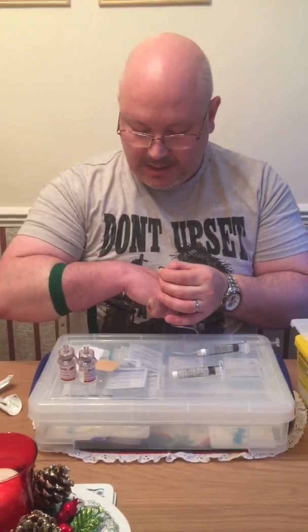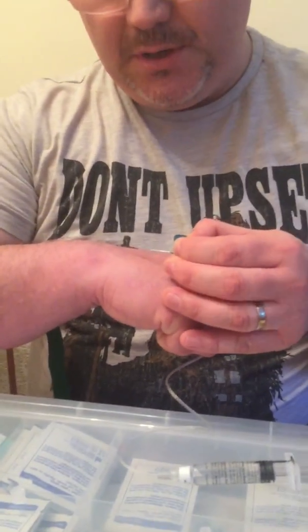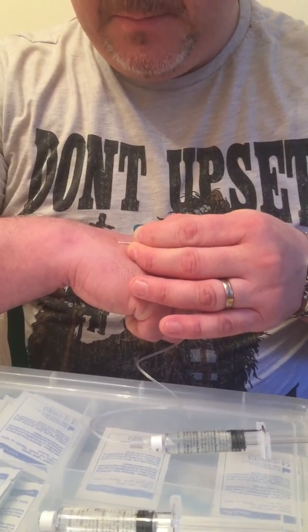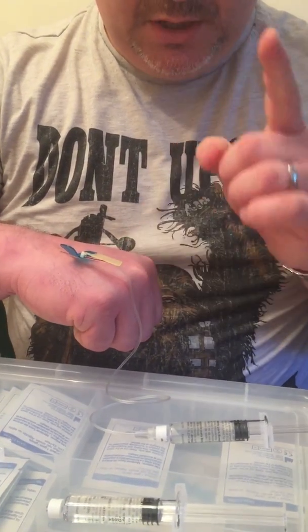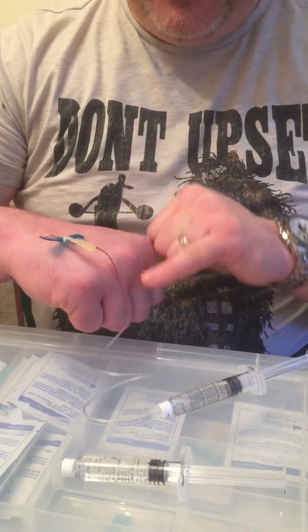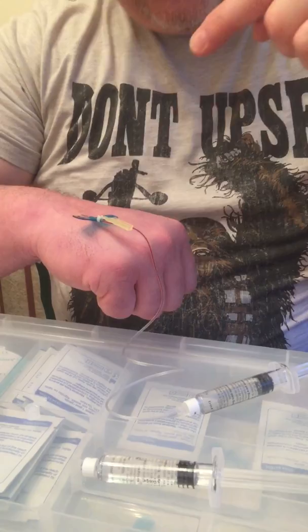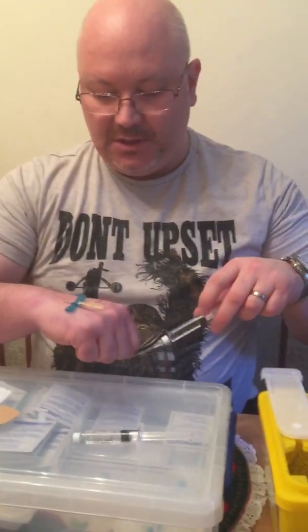Find the vein, needle ready, and go in at a slight angle. Don't go in at too much of an obtuse angle — you want to go in at an acute angle, just nicely to go into the vein. Find the run of the vein and go along the line of the vein. Push down and forwards — you'll feel a pop of the vein. You should see a little bit of blood come up the tube. If the blood's coming up the tube, you're in the vein. I'm just going to draw back on the syringe very slightly to make sure the blood free flows — if it free flows it means I'm still in the vein. Once I've reached this point, just press the buttons to release the tourniquet and I'm now ready to infuse the clotting factor.